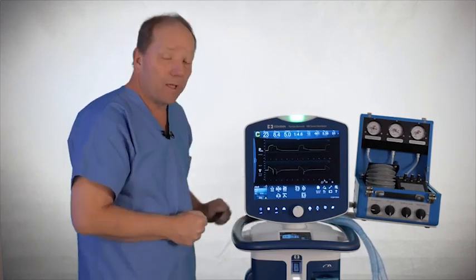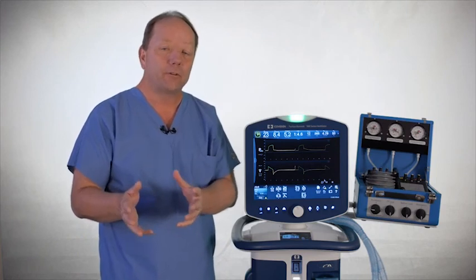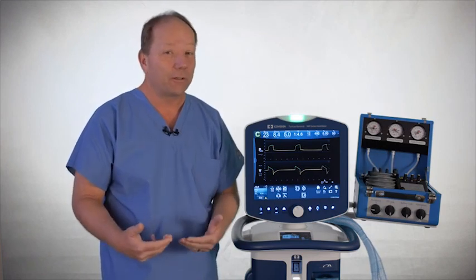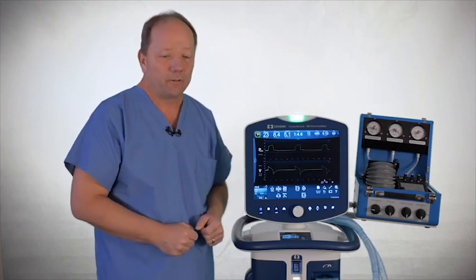One other option that you have when you set a patient up is you could just put in the gender and the height, and then you can go right to what's called a quick start. So if you're comfortable with all the settings, you need to get going very quickly, there is an option to go right to a quick start by simply putting in the gender and the height.